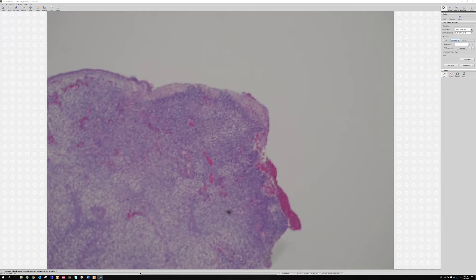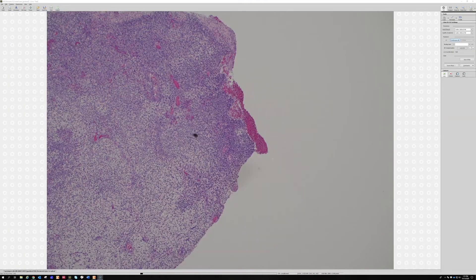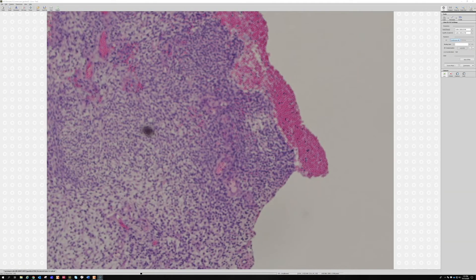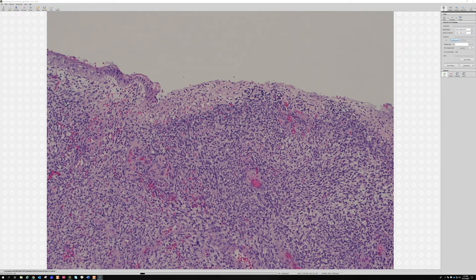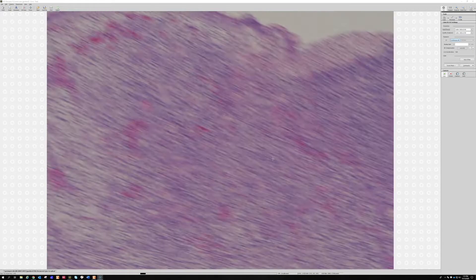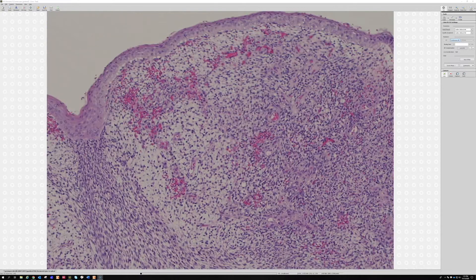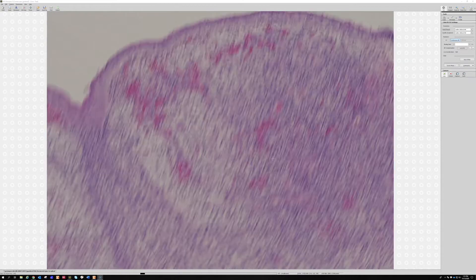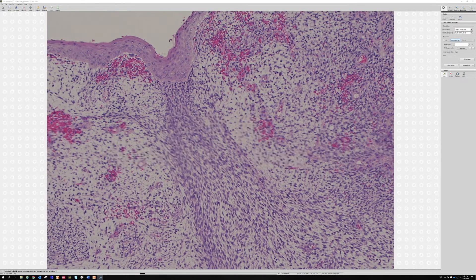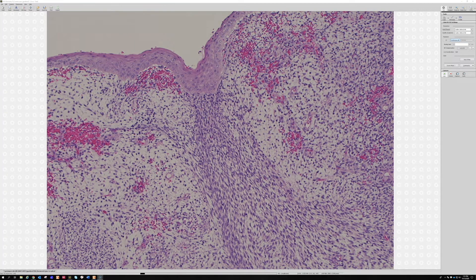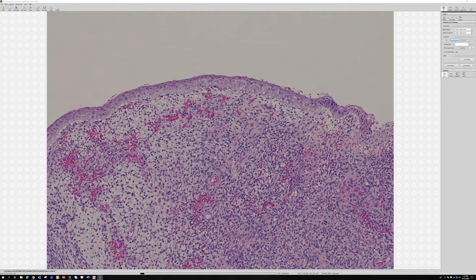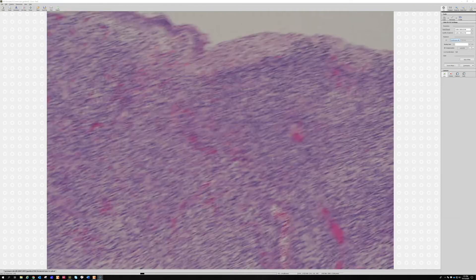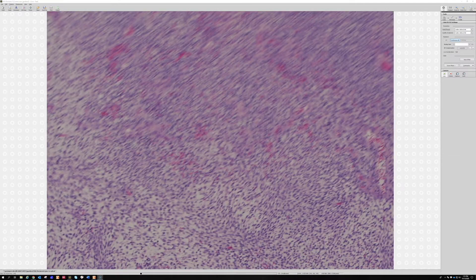Here we get a little bit more cellular area kind of up here, right under the surface. So did you have an idea for what this might be? I came up with a differential — two things: a fibroepithelial stromal polyp versus embryonal rhabdomyosarcoma, the botryoid type.